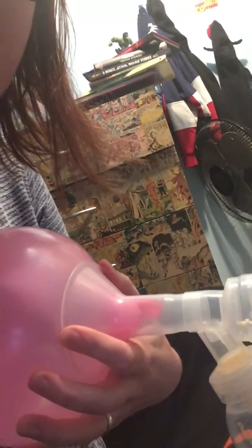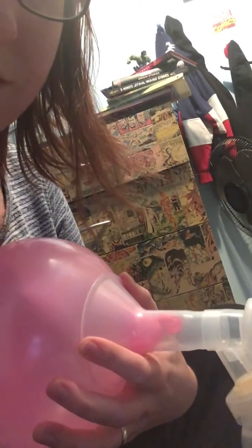The next thing you want to do, as soon as your milk lets down, you're going to hit this little yellow button that's in here, right there. You're just going to push it. Okay. Did you hear the change in the pump? Can you see a change here in the rhythm that it's pumping? It's slowed down just a little bit. Okay? Your pump is going to be most effective when it is in that slower pumping mode after your milk has let down.